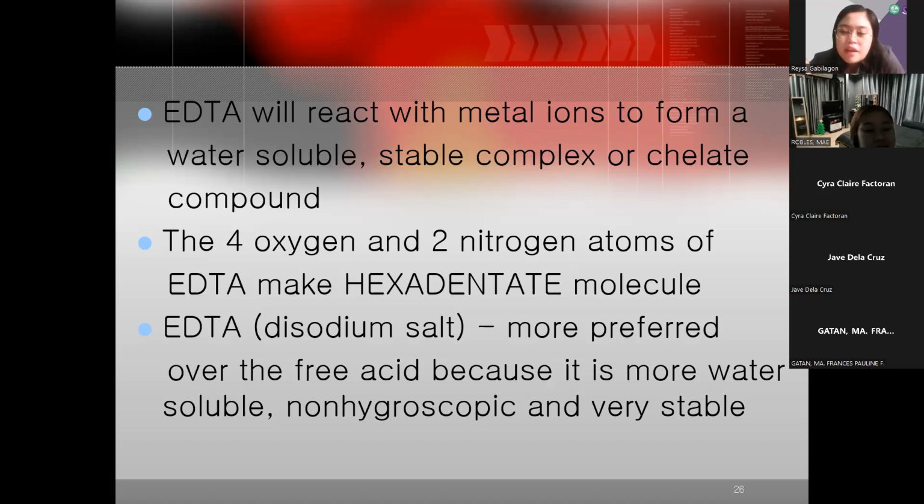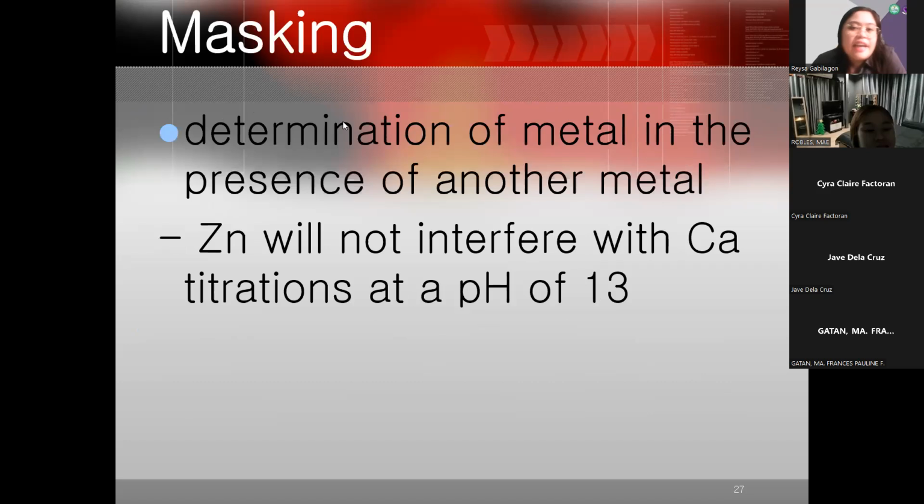So the tube there has EDTA in it to chelate calcium ions. So calcium ions in the blood, meron yan siyang function for blood clotting. So if they want to preserve the blood for their laboratory procedures without having it mag-clot, then doon nila ilalagay sa EDTA tube. Yan yung work ni EDTA.